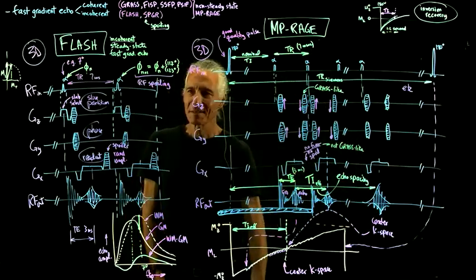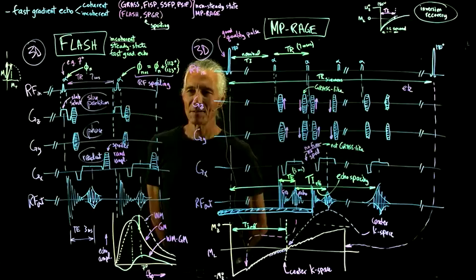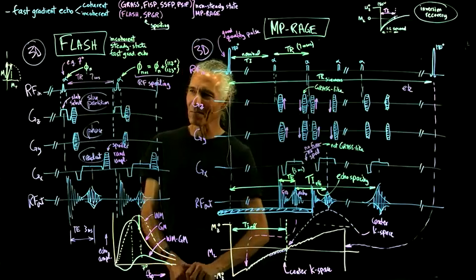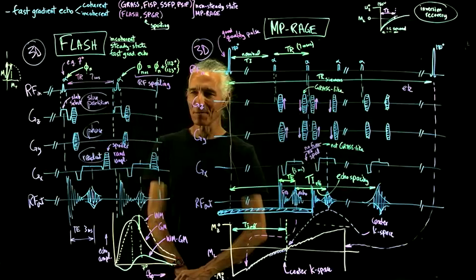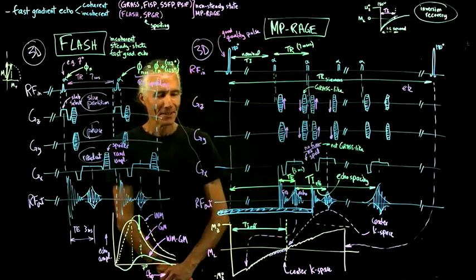Okay, so any questions about this sort of conceptual development of these sequences? So on Friday I'll talk about MP2RAGE, because there's an MP2RAGE. We have that one on the scanner too. It's a useful one. Okay.